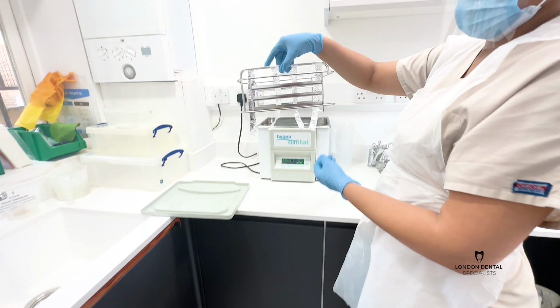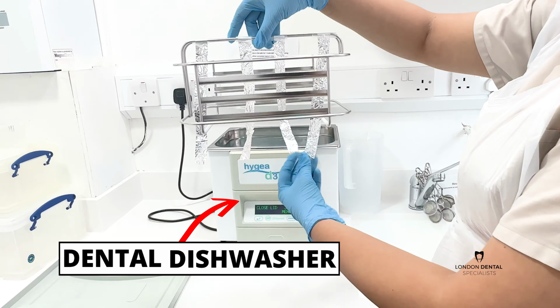We're starting with these pieces of foil to show us what you do with this. Again, those pieces of foil are then put inside the machine, generally submerged, and then we start the cycle again.